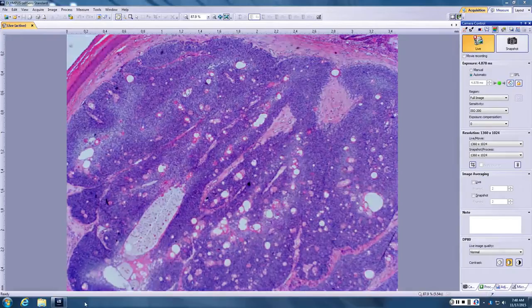So this is a blue nodule with red ducts. So you know it's sebaceous. And now the question is just, okay, sebaceous what? Adenoma, epithelioma, carcinoma. So looking at it, how well differentiated does this look? Do you see a lot of sebaceous differentiation? No. And when you look up on the screen, are there a lot of nuclei? Yes. And are some of the nuclei darker and bigger than other nuclei? Yes. So maybe sebaceous carcinoma. Yeah, I think you are correct from scan.